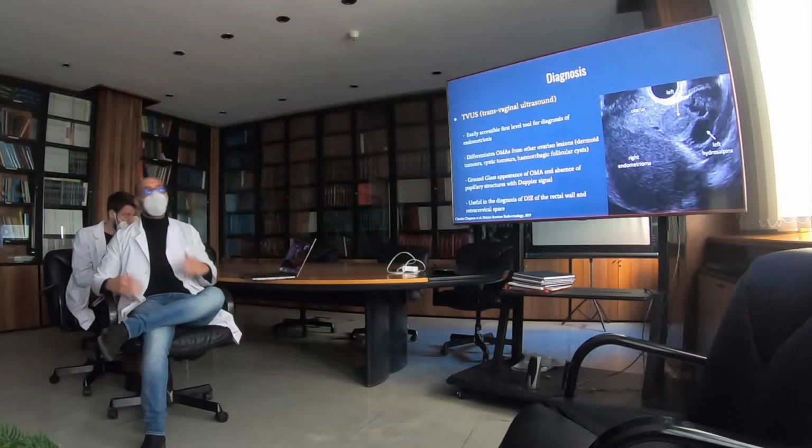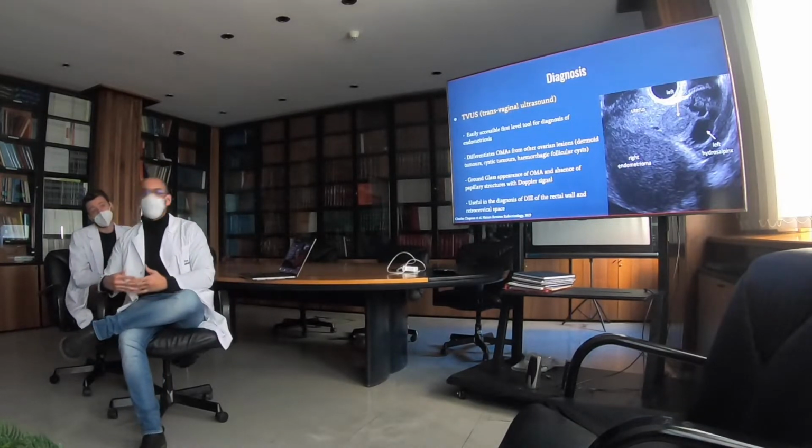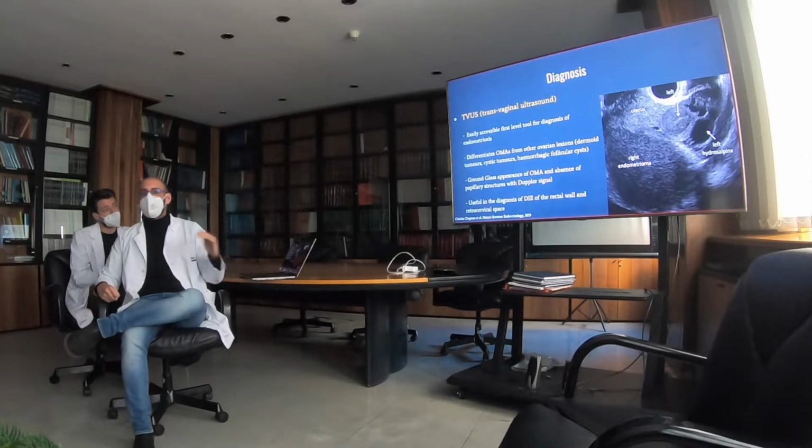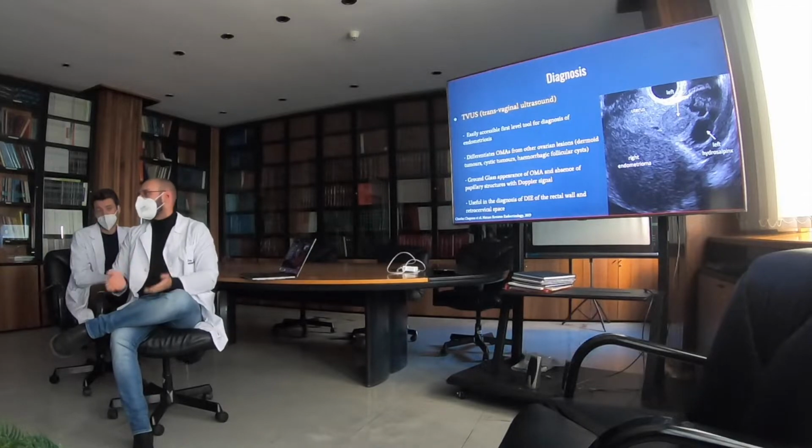Now, talking about the instrumental diagnosis, we start with the TVUS, which is the transvaginal ultrasound, which is easily accessible and does not use, of course, ionizing radiation nor contrast agents.